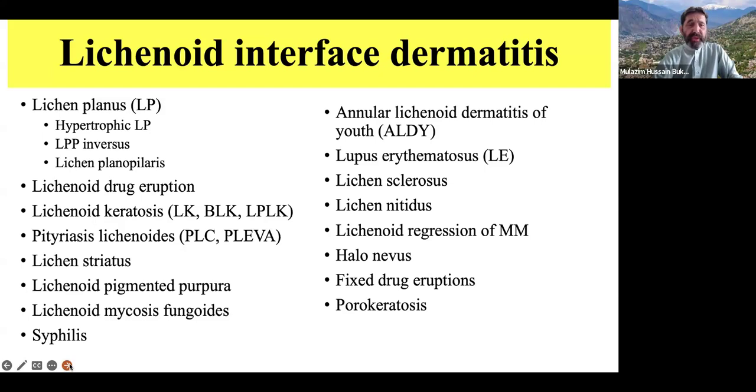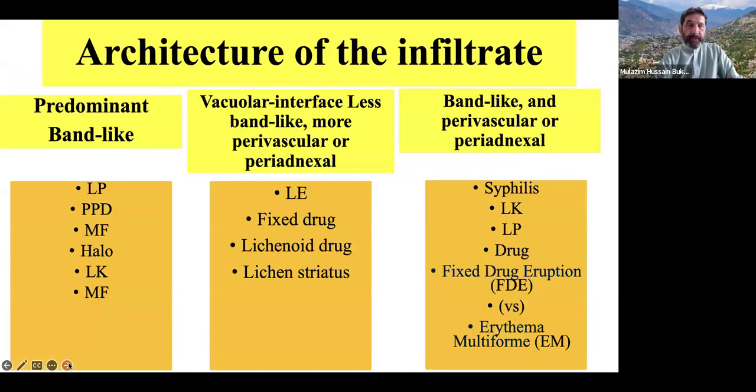A very interesting case came to me for review, and someone had given it as a plasma cell tumor, but when I revised the slide, these plasma cells were benign, but there was other history, that was syphilis. So it is a very important thing that you can decide if you have certain criteria in your mind.